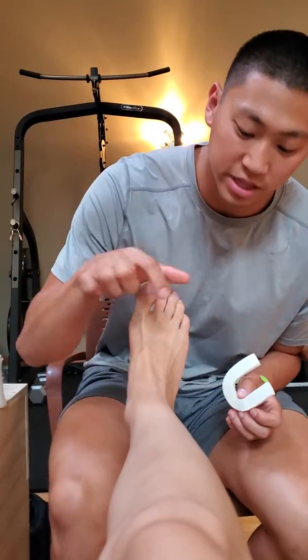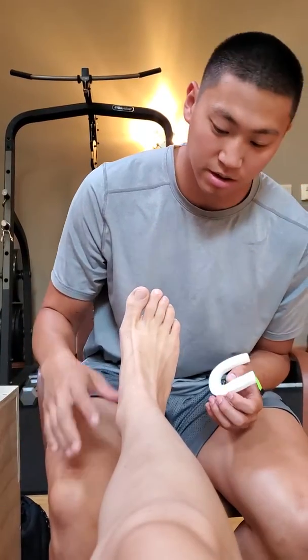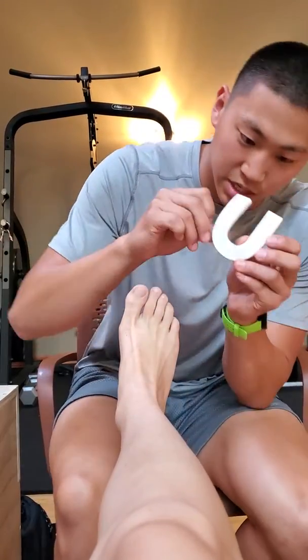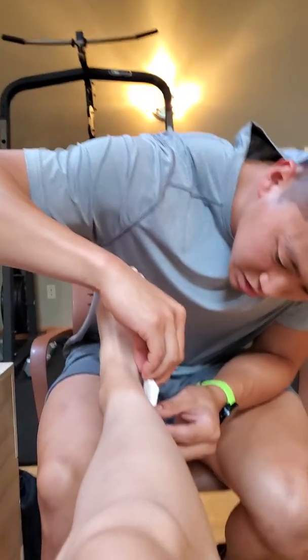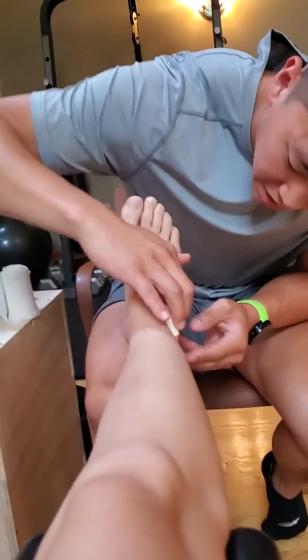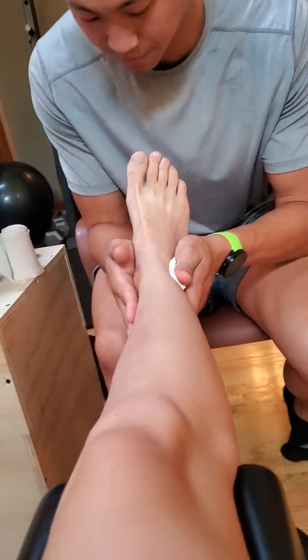First I'm going to spray the client with adhesive spray. I'm going to place the horseshoe pad right around the lateral malleolus to fill in any swelling areas that may pool up.